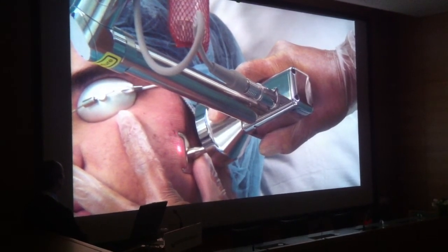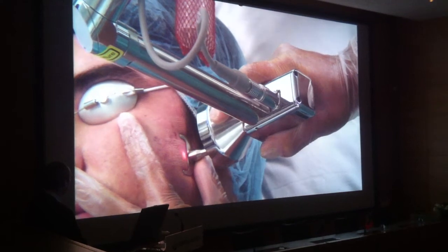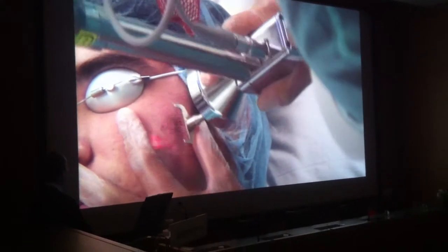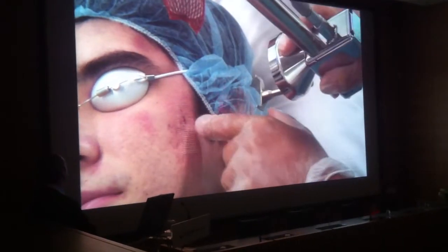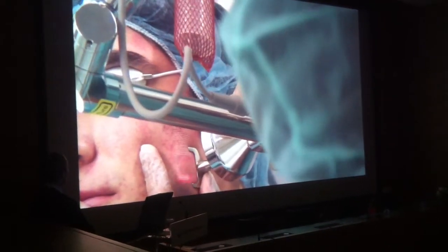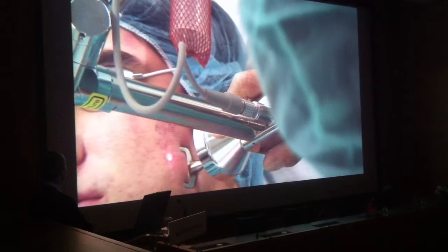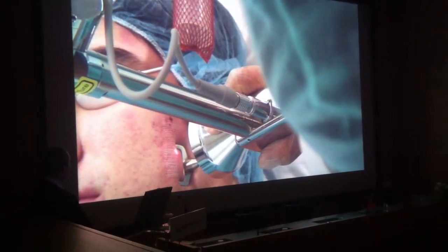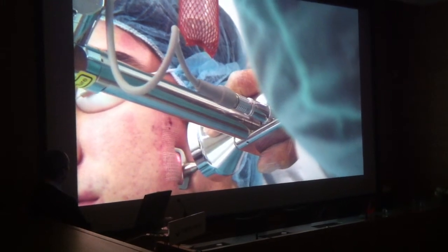As you can see, I warned him that if the treatment is not tolerable, he should tell me immediately. Now, even though the coagulation here is quite good, where the fresh lesions are, it's still possible to see some very small bleeding, but you have that with any laser. As you can see, I'm not keeping my hand still because I don't want to hide this from the camera, and the treatment is not only tunable, but also perfectly tolerable.